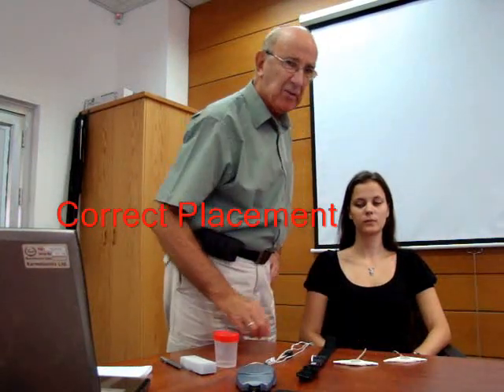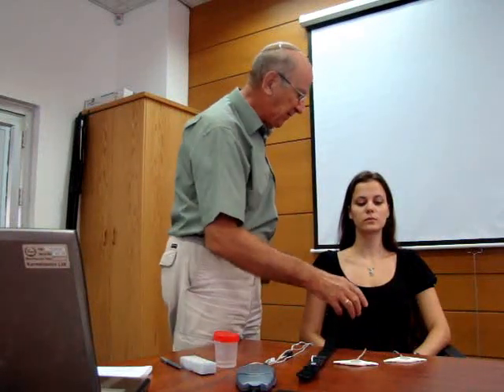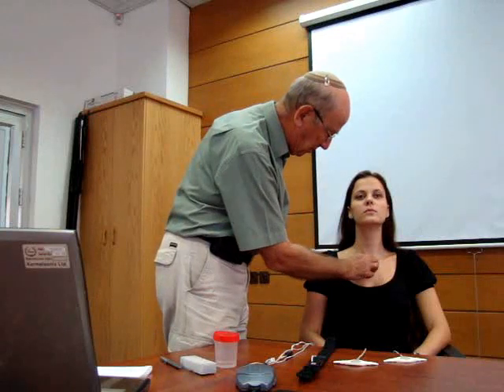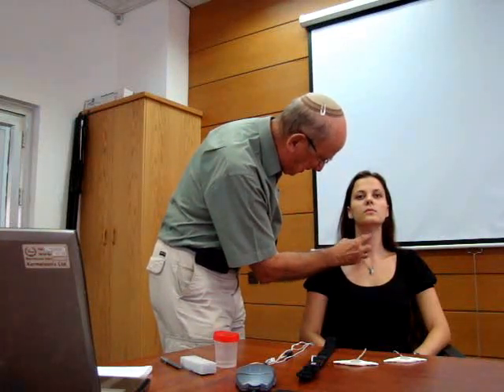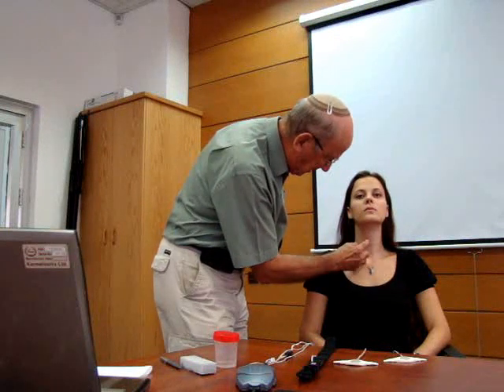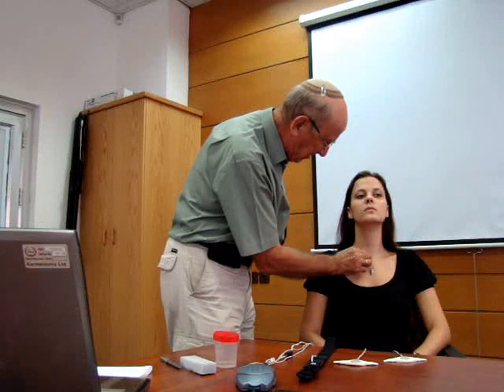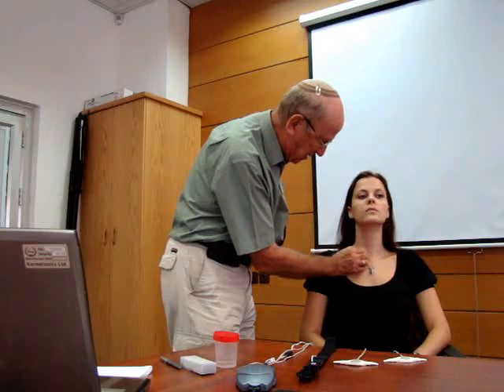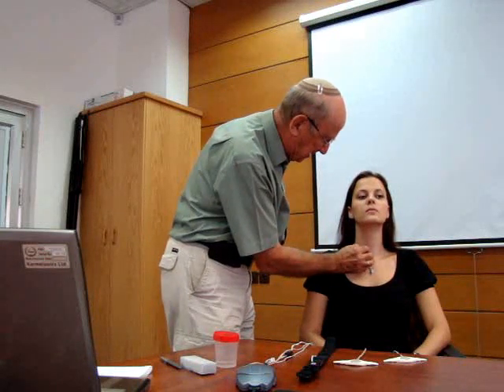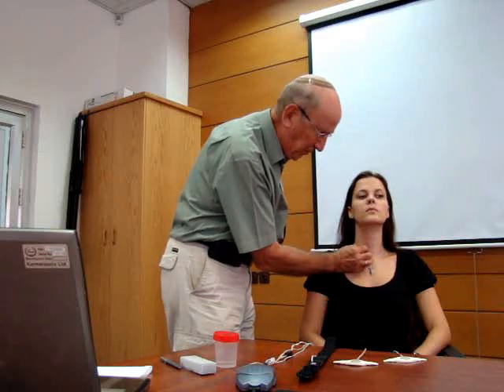In order to place the sensors correctly, we have to define the anatomical landmarks. For the trachea sensor, we define the following landmarks: the suprasternal notch, which is just here, and the larynx, which is here, and we define the midline here. The sensor has to be placed in the anterior triangle, so it's anterior to the sternomastoid muscle, and we're going to place it just about here with the edge of the sensor just on the midline.